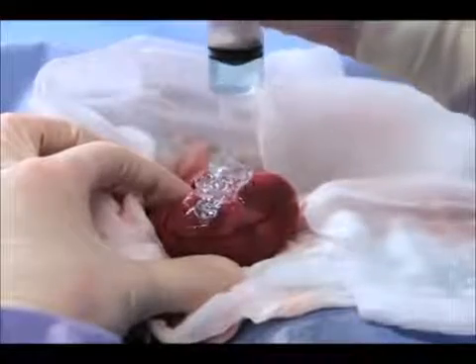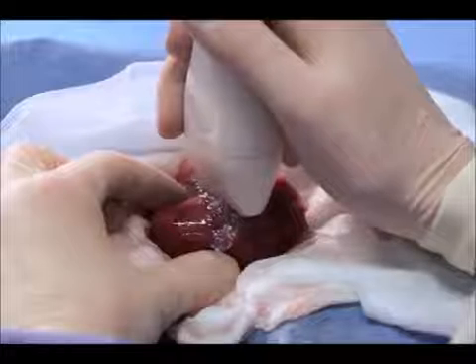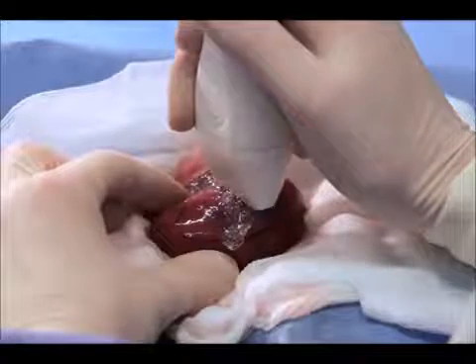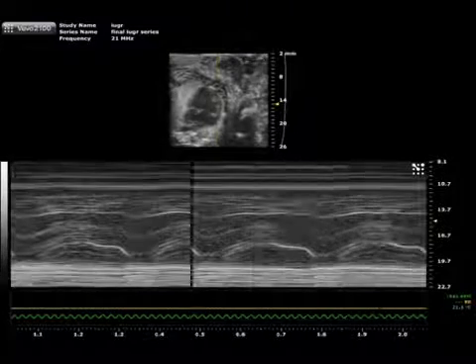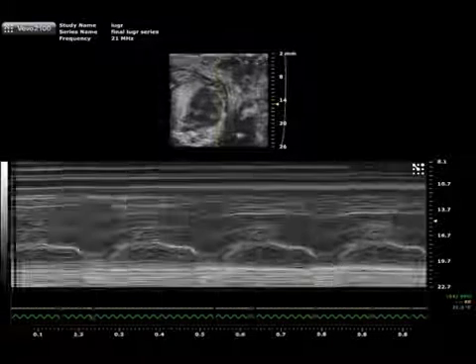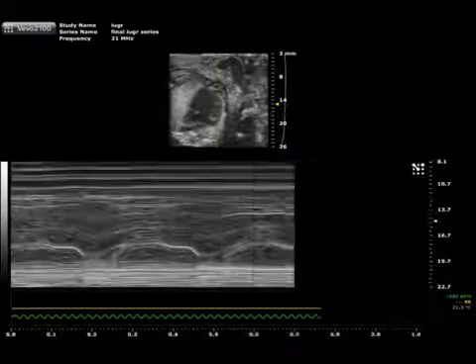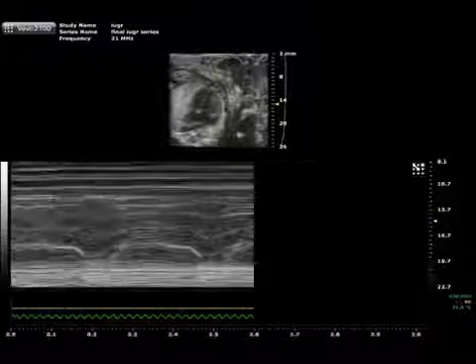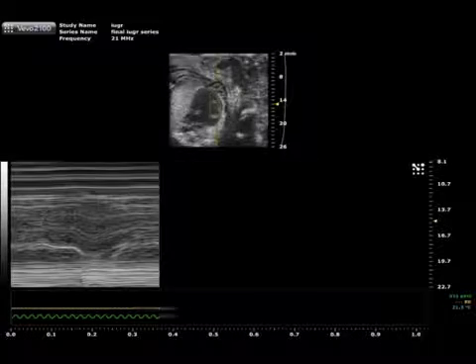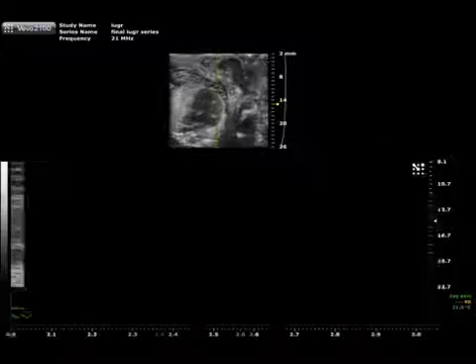Next, at the level of the apical 4-chamber view, repeat the B-mode cineloop and use M-mode echocardiography to assess tricuspid and mitral annular plane systolic excursion and longitudinal strain and strain rate. This apical view also permits assessment of valvular flow velocity waveforms and the modified myocardial performance index.